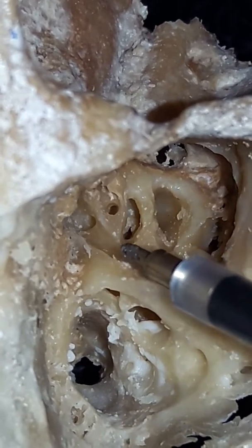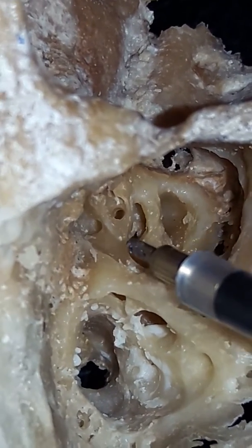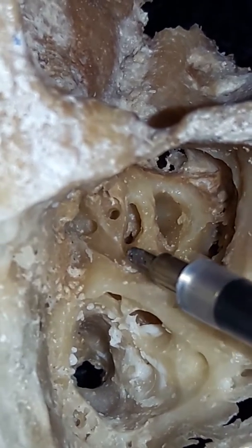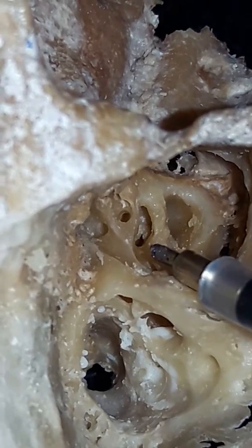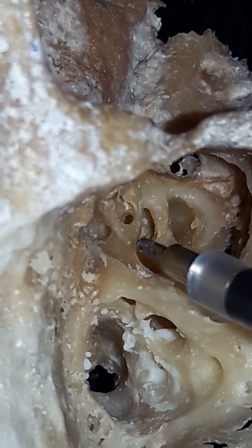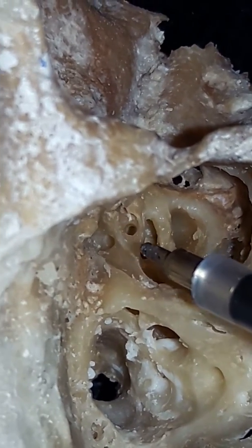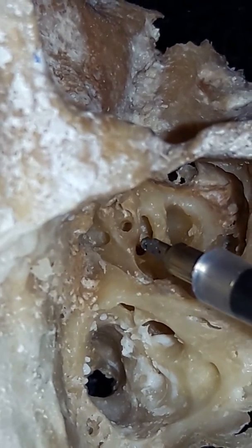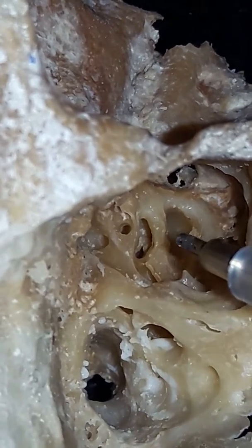Now, what about the middle turn cochleostomy? Just 1 mm anterior to the anterior border of the oval window here, that becomes the middle turn cochleostomy. In the middle turn cochleostomy, scala vestibuli is larger than scala tympani, whereas in the basal turn, scala tympani is larger than scala vestibuli.